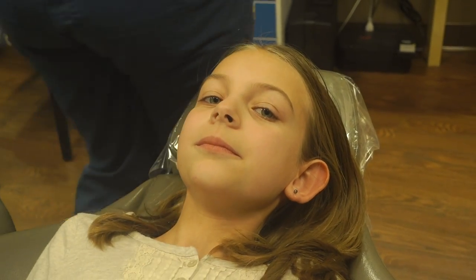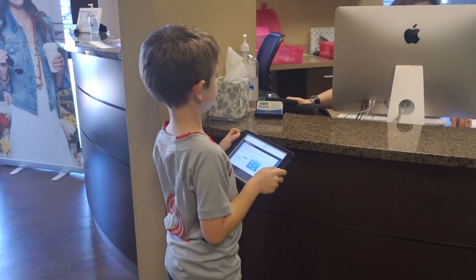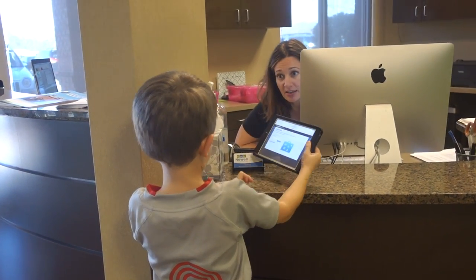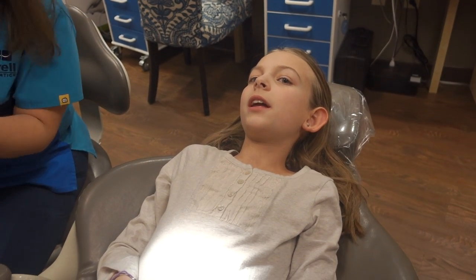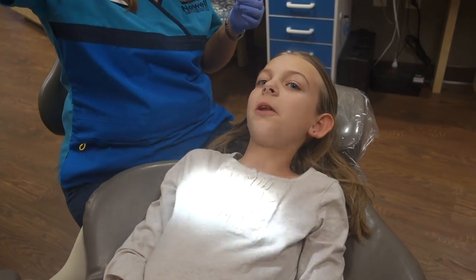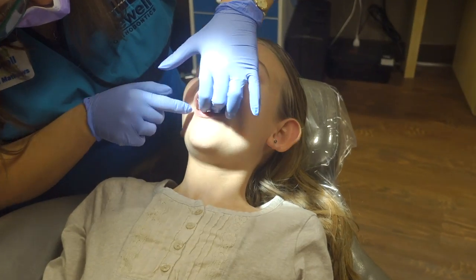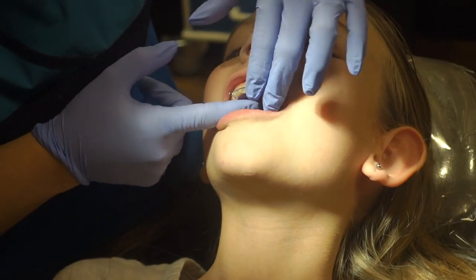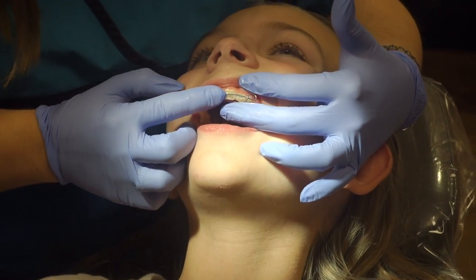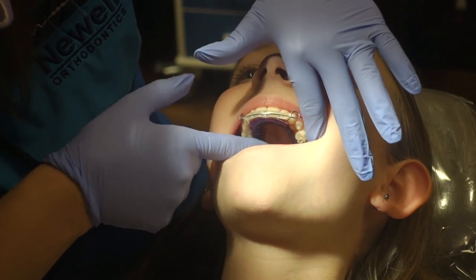It wasn't that long ago we were here. Okay, just hang tight right here for me. What's it doing? Is it just that thing? I don't like it. I don't know, I'm not going in on the back. Do you have a problem here before? No, I can't look at it. Don't do it. Does it look like she bent it or something? It didn't look bent while it was out of her mouth. The molars look good, they fit good.